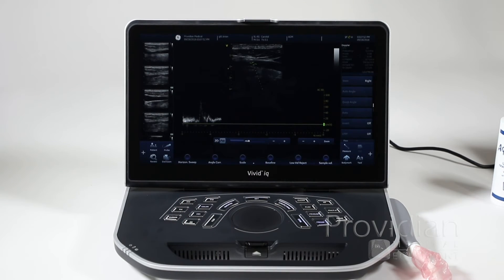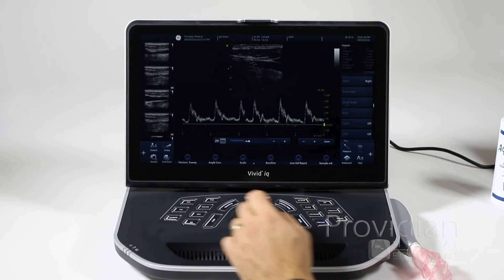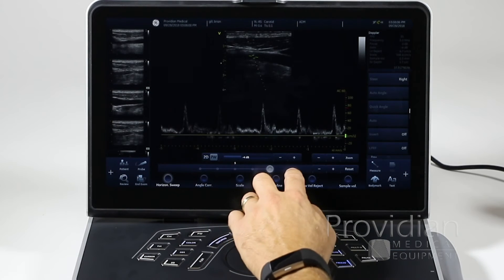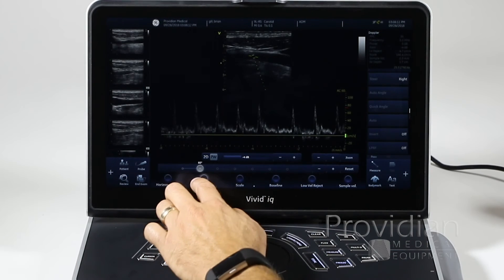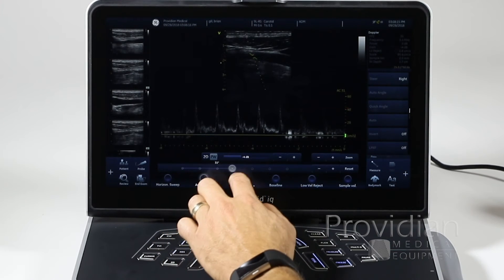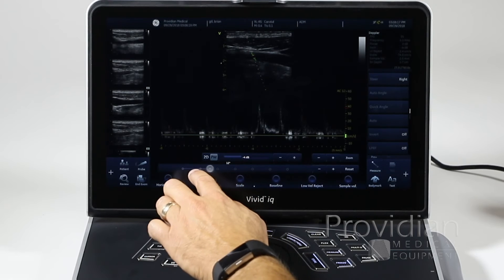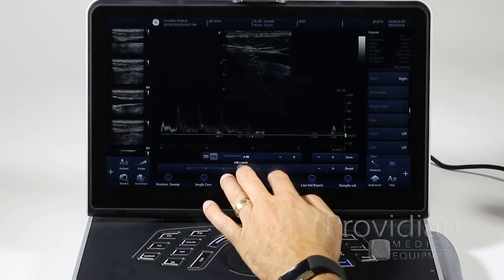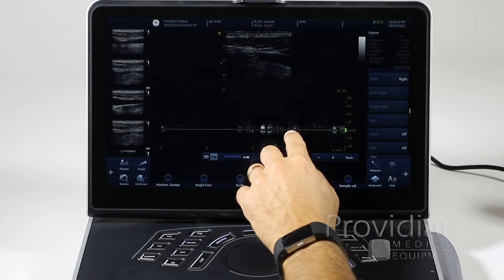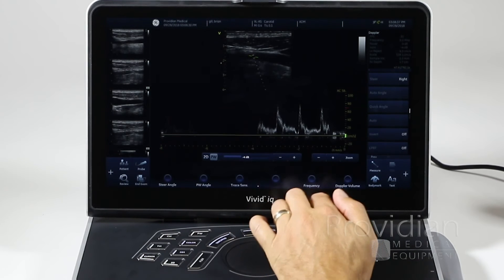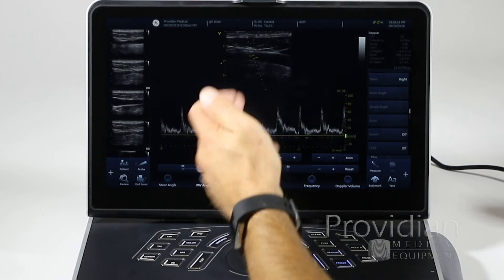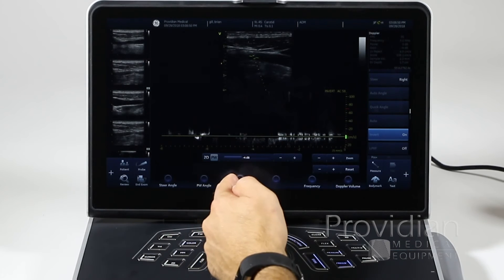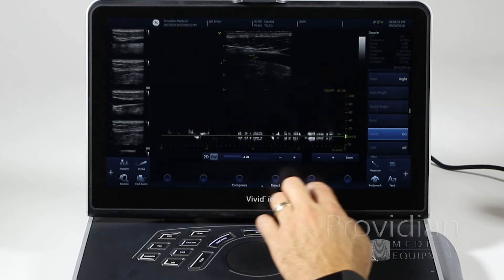You can also do it by pressing PW, and when I'm ready to go, I just push PW again and I've got my spectral here. Across the bottom we have our angle correction, horizontal sweep speed — I can increase or decrease. Angle correction lets you go various angles, just slide right along the slider. Your scale, obviously. Baseline can be moved up and down with your finger. Low velocity rejection, sample volume size, steering angle, angle of the pulse wave line. Trace sensitivity, frequency, and you can adjust your Doppler volume there.